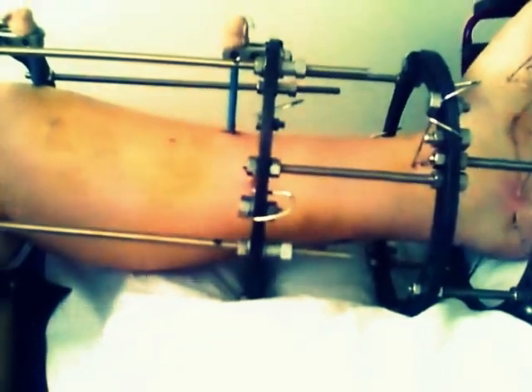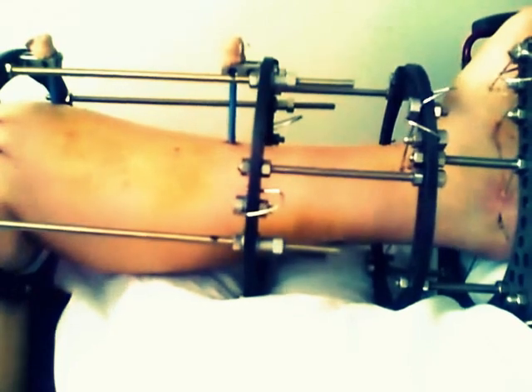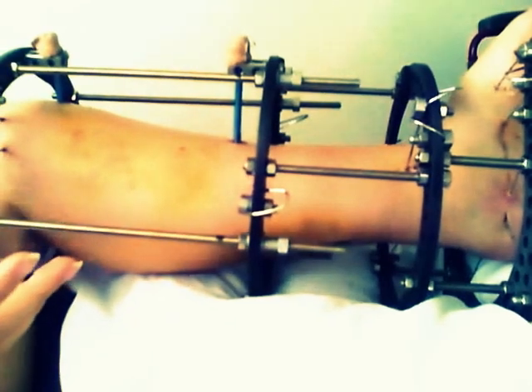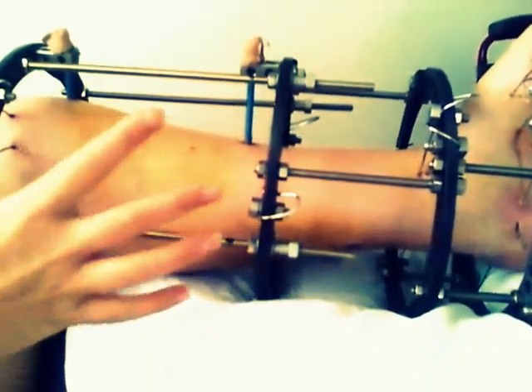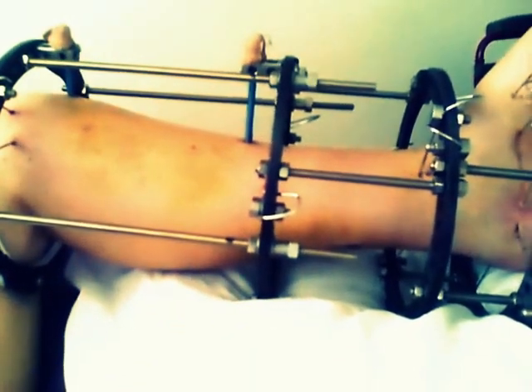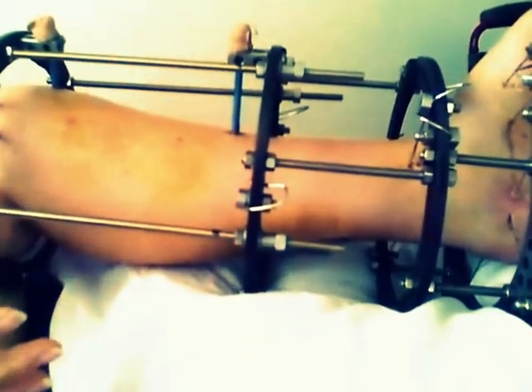Then when this comes off, I have a cast on my leg for 6 weeks so that it fully repairs before we take all this off, so we won't damage my leg. After that, I'll be able to walk on it properly without having to wear a shoe raise so I can have 2 legs the same length. I personally would rather have this operation than wear shoe raises for the rest of my life.